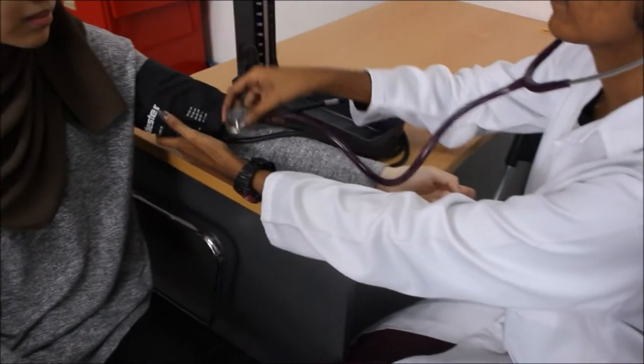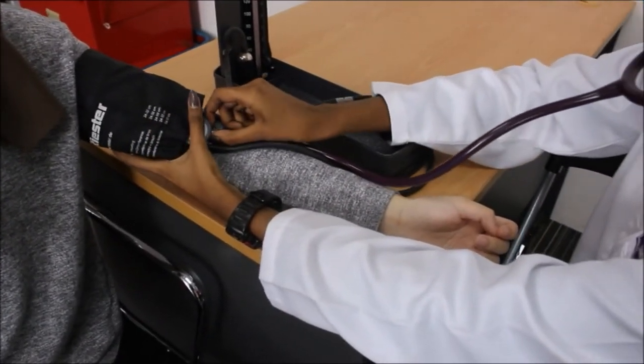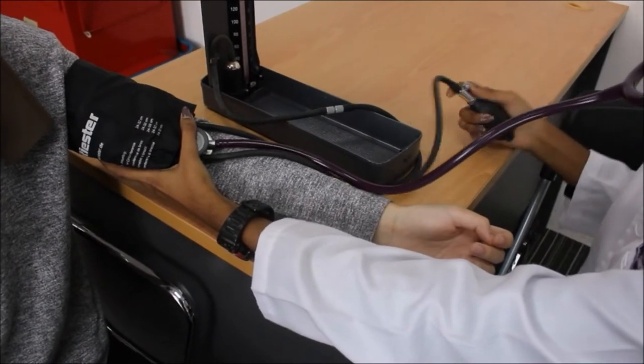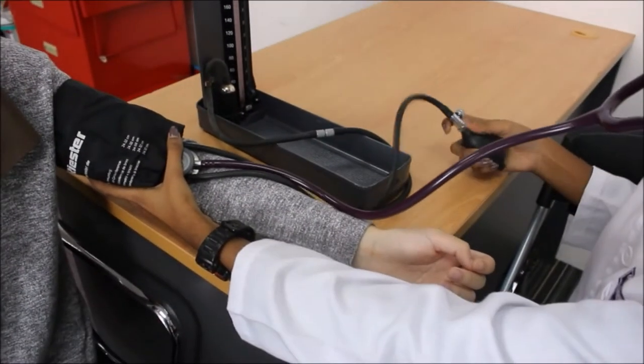Place the diaphragm of the stethoscope onto the brachial artery and inflate the cuff, adding 30mmHg to the initial reading.